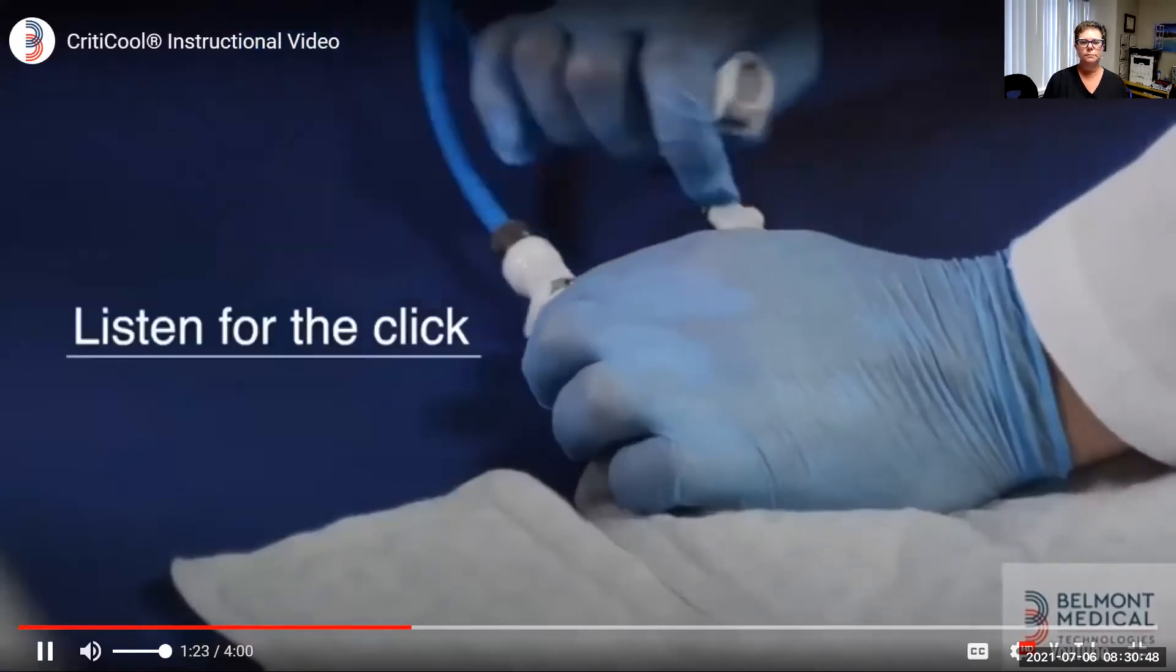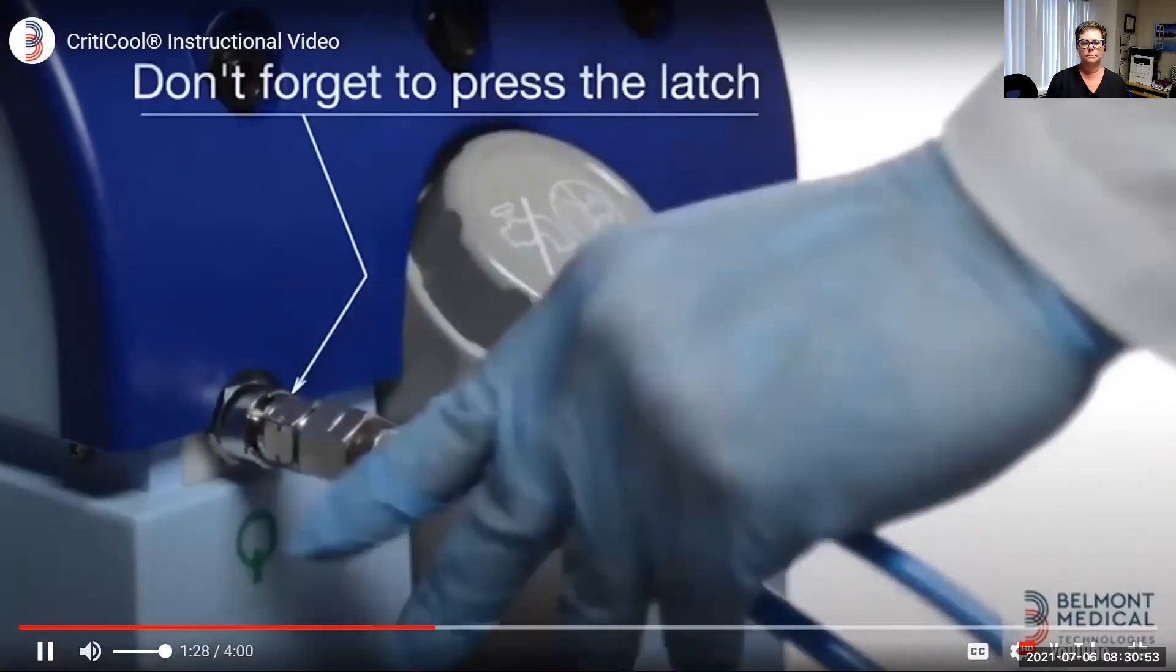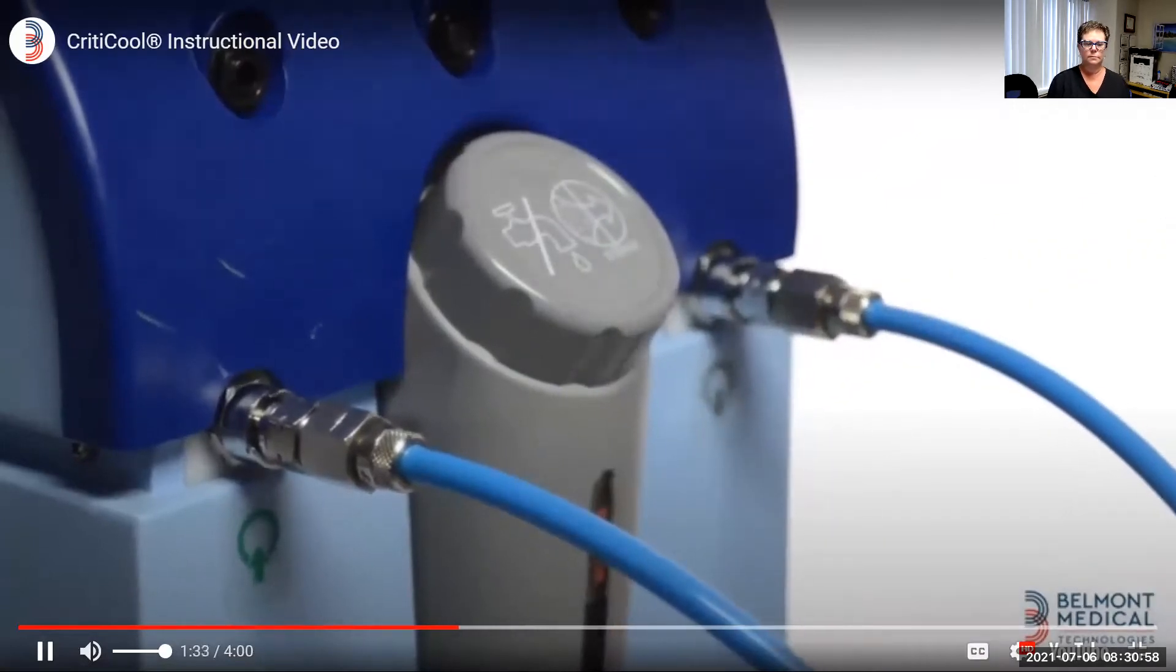Connect the hoses to the wrap and to the CritiCool system as shown. When connecting the hoses to the system, be sure to press the latch on each hose as you insert it. Either hose can be inserted into either side.